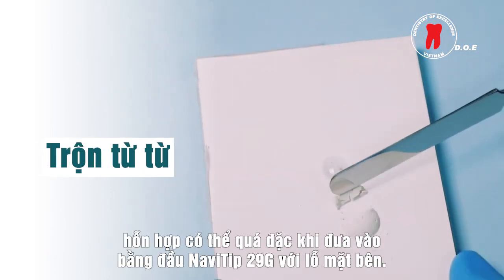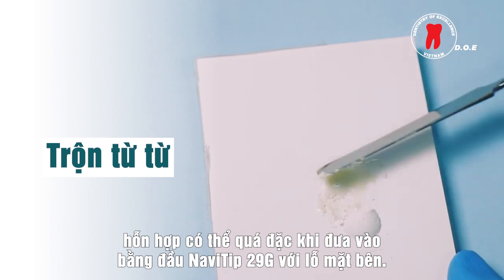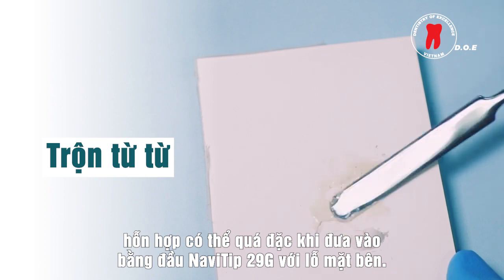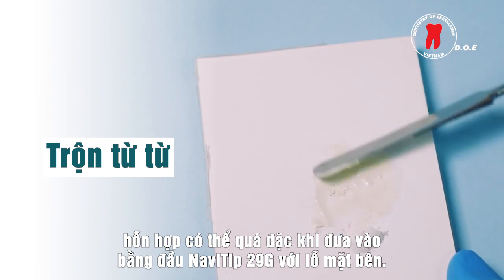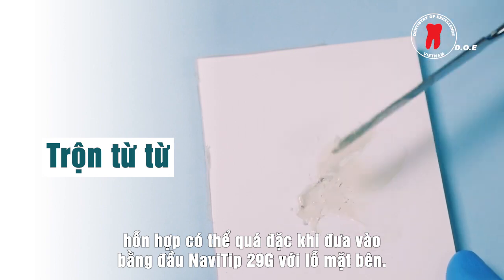Next to the powder, gradually combine the powder in small amounts into the gel to achieve your desired consistency. If the powder is not added gradually in small amounts, the consistency may be too thick to dispense with the Navi tip 29-gauge single side port tip.